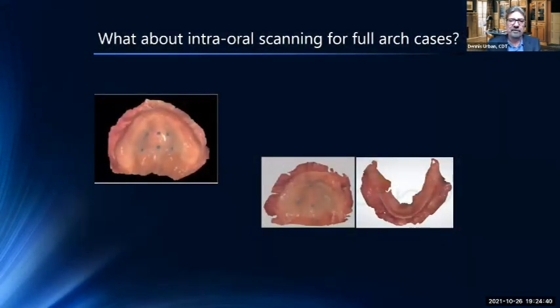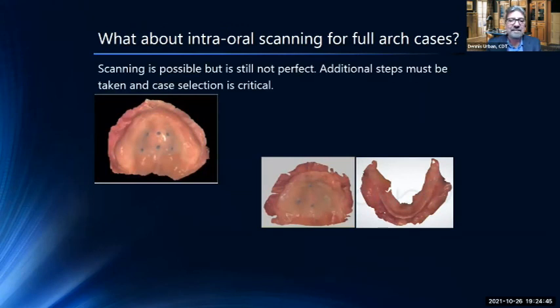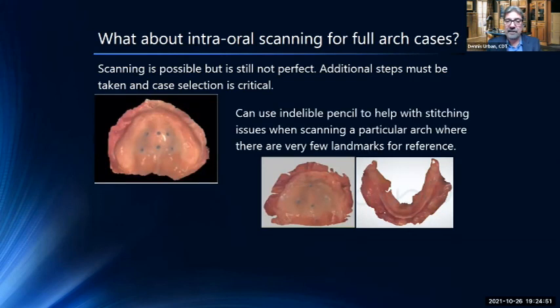So what about intraoral scanning on full arch cases? Well, I get that question asked a lot. Scanning is possible, but it's still not perfect. Additional steps must be taken, and case selection is critical. You can use an indelible pencil to help with stitching issues when scanning a particular arch where there are very few landmarks for reference. I see this a lot with this indelible pencil.